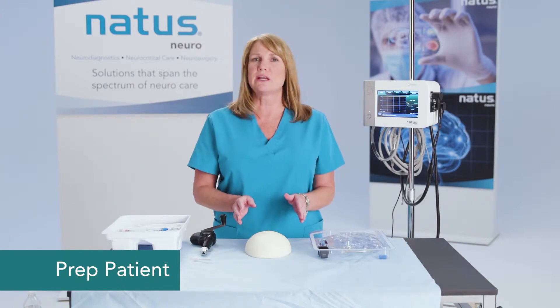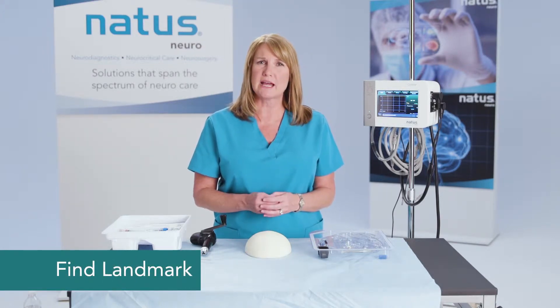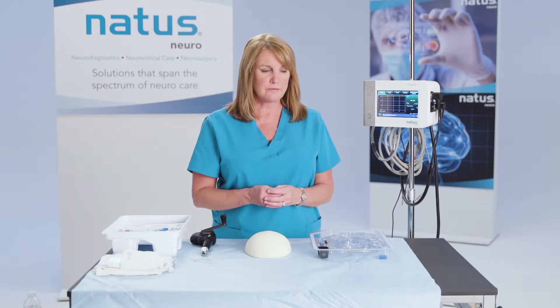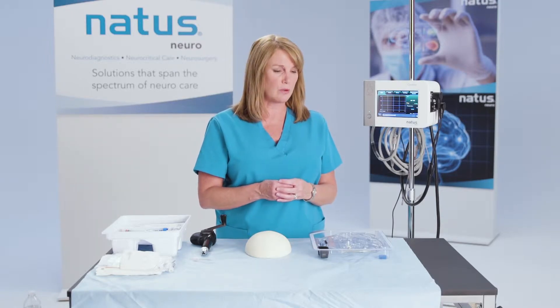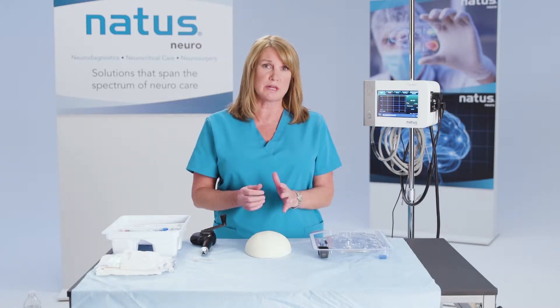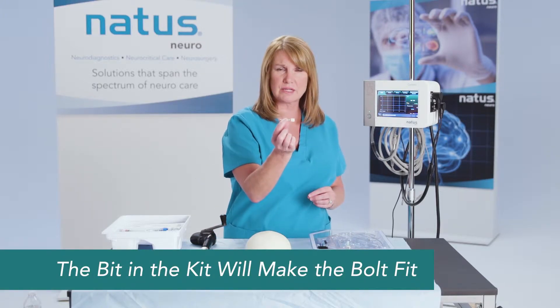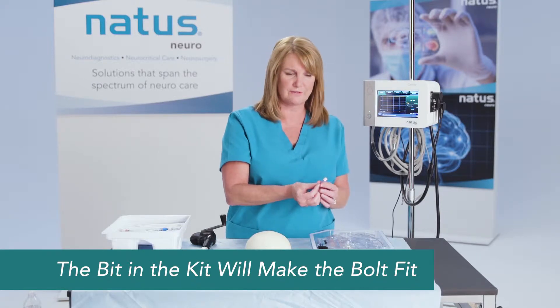You'll prep the patient like you normally would and find the landmark where you want to access through the skull. The first thing you're going to want to do is make your stab incision through the scalp, and then you're going to need to open up that skull. To do that, you want to use the drill bit that comes in the catheter kit. Remember: the bit in the kit will make the bolt fit.